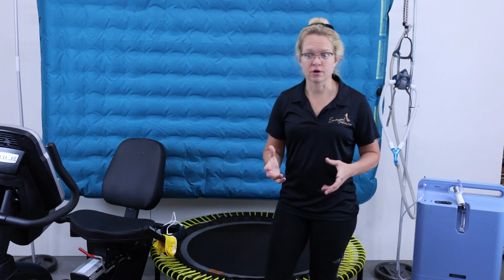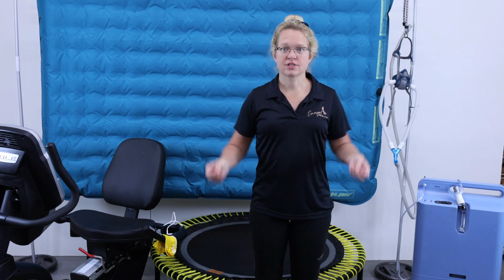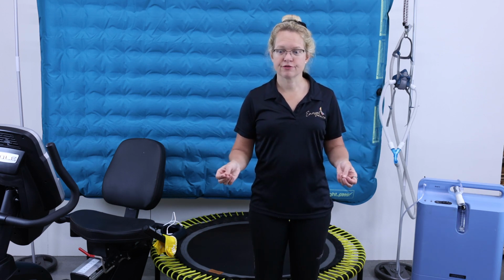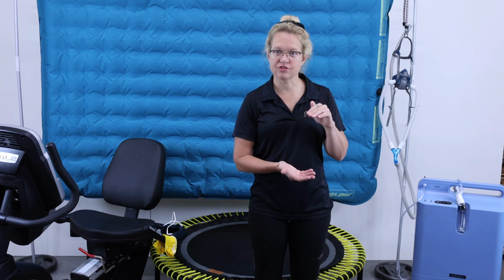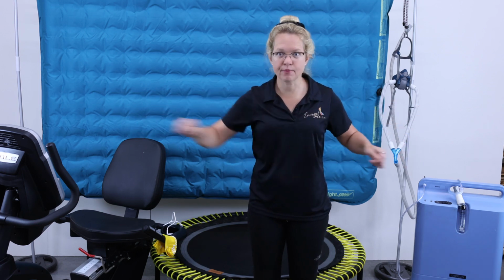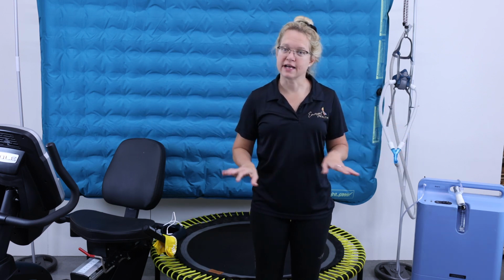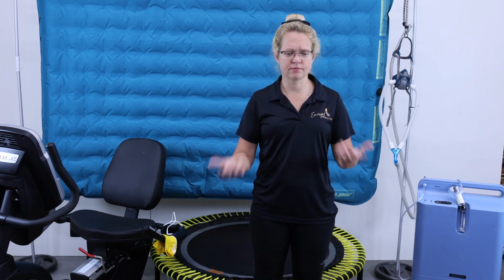Another oxygen reservoir bag that people typically use is a waterproof mattress cover from Walmart. This is like a queen size, not the box spring, but the mattress itself. You can get a really deep plastic bag with a zipper that you put the entire mattress in. Those work fantastic as oxygen reservoir bags, but they are not TPU lined polyvinyl, so some people say they might off-gas and that may cause problems.